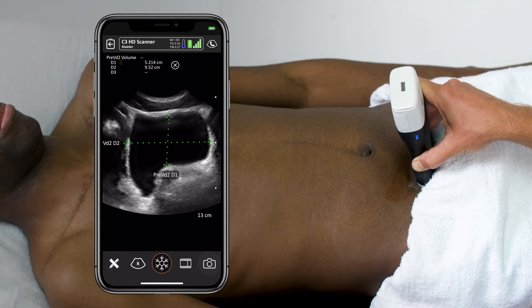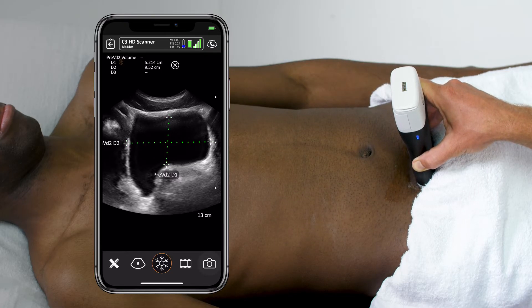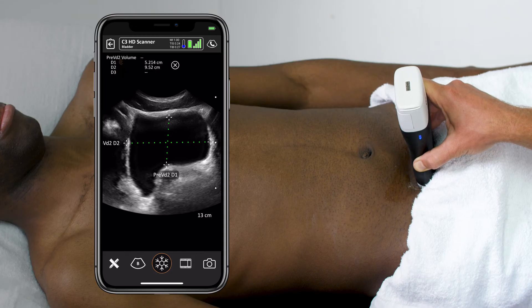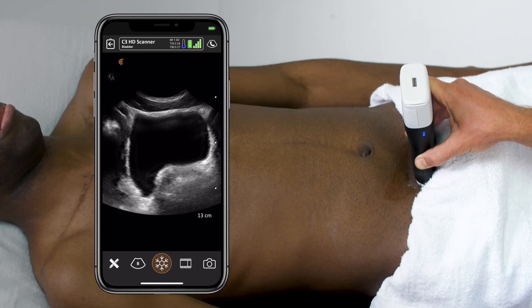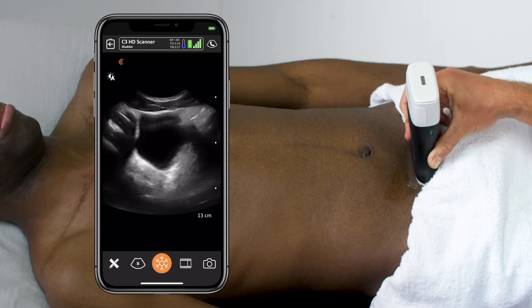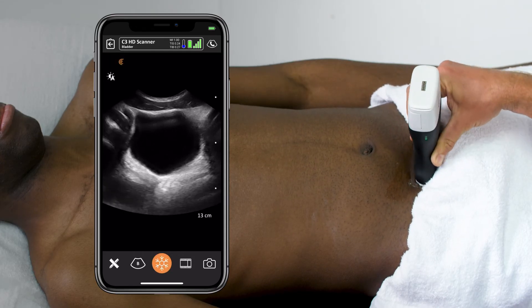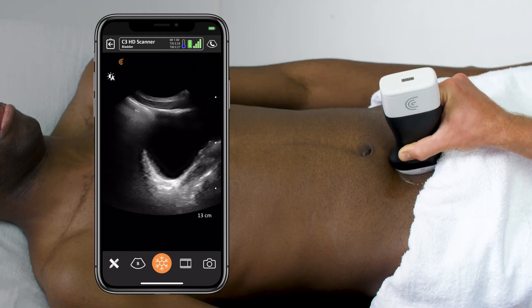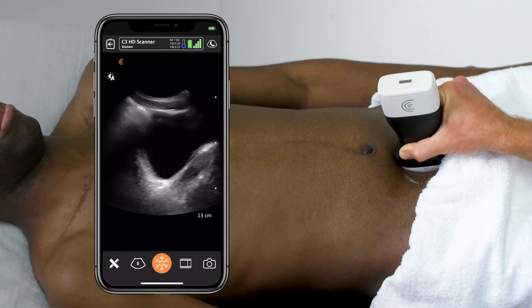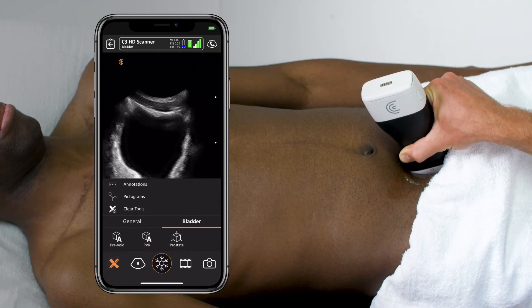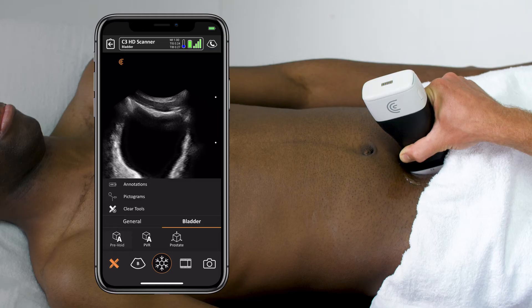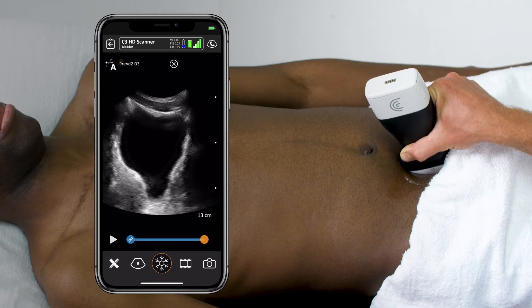I can save it by pressing the camera icon, then I will unfreeze the image and, keeping the bladder in view, rotate into the sagittal plane with the indicator towards the patient's head, making sure I get both walls of the bladder in view.